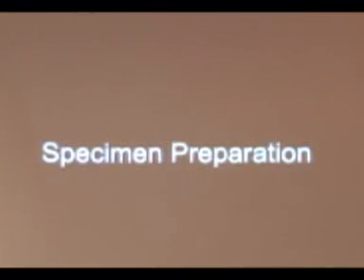And it's really the making of the slides that is almost more difficult, I think, than the actual performance of the procedure itself. So here we place a little dot of specimen on the glass slide. You really need at least 2 people, I find, to help you with this. And then we send it off. So we can go on to the next slide now, please.